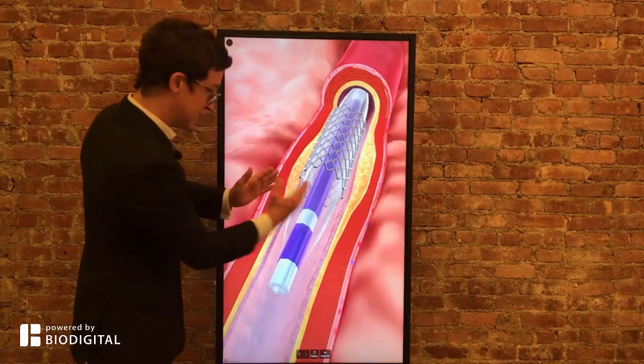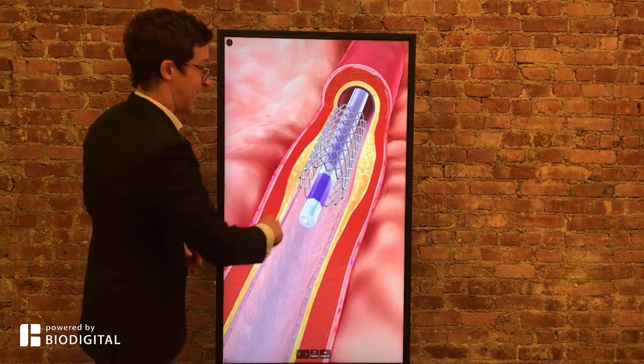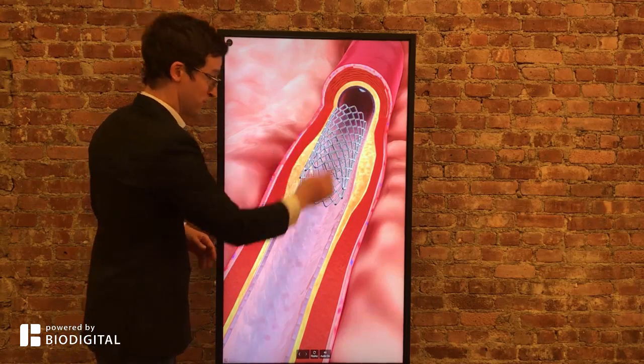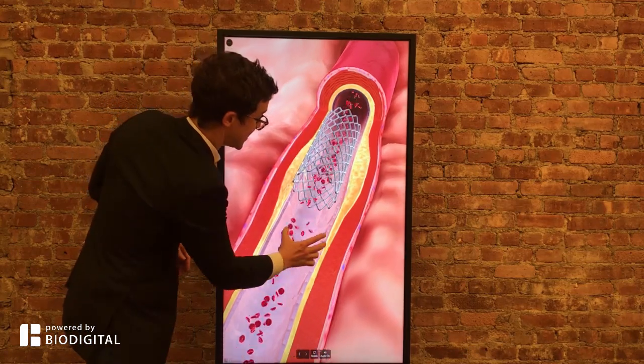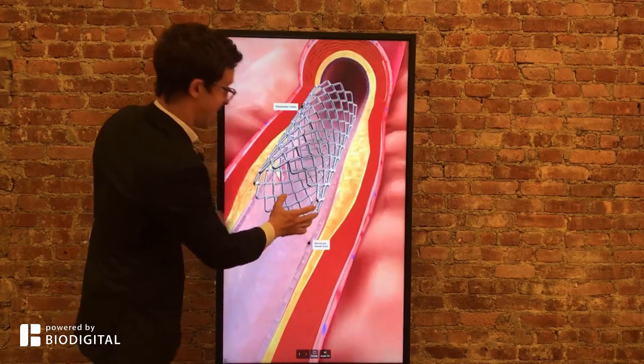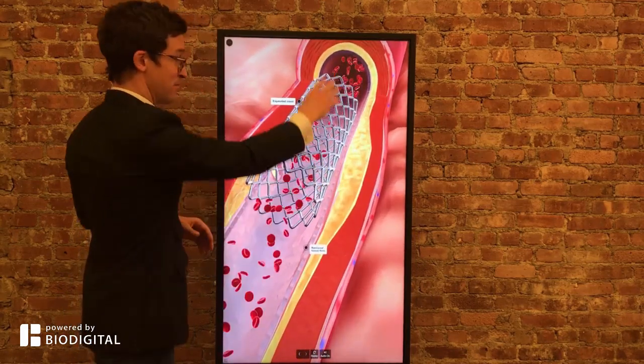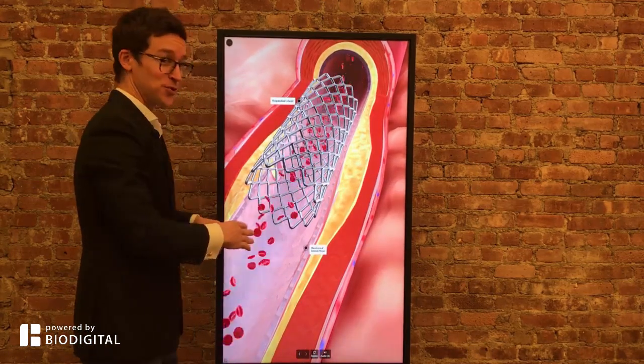The balloon is then deflated and the catheter is removed. The stent stays there nice and open. Blood flow is restored.